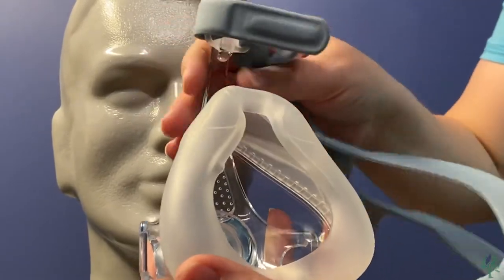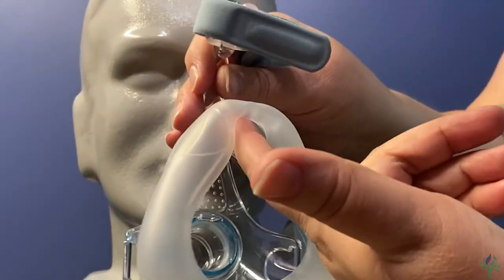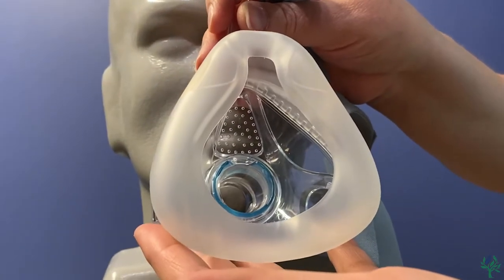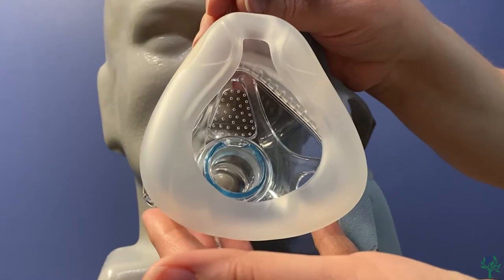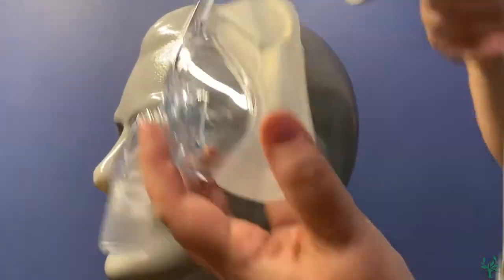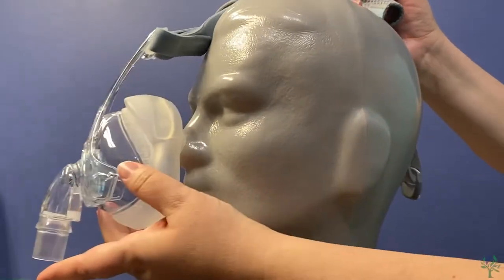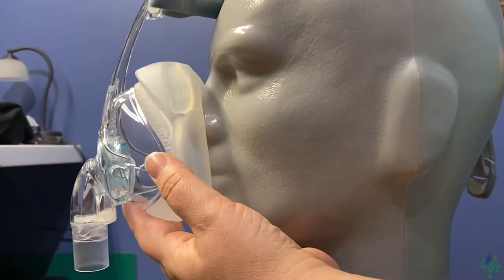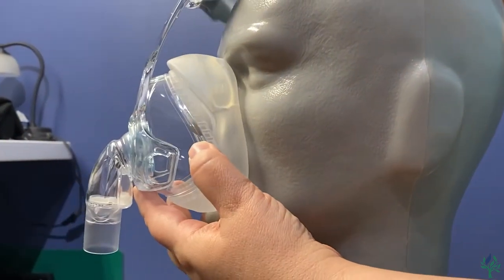The first thing that you want to look at on this mask is this little piece here. It's very thin, so as you're putting this mask on, you need to be careful that it's not getting turned the wrong way. The best way to do that is, as you put it on, just let it kind of fall against your face here. You don't want to be going up or down because it will turn that piece the wrong way — just let it fall against the face.